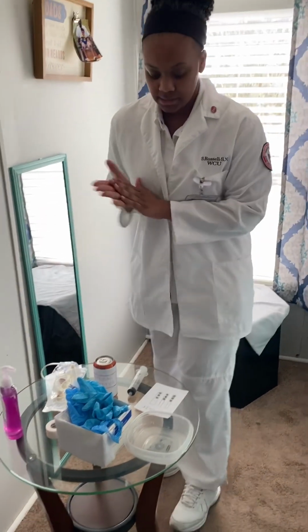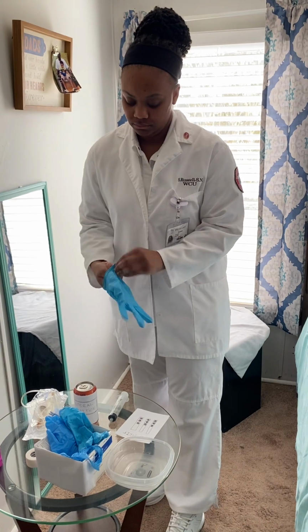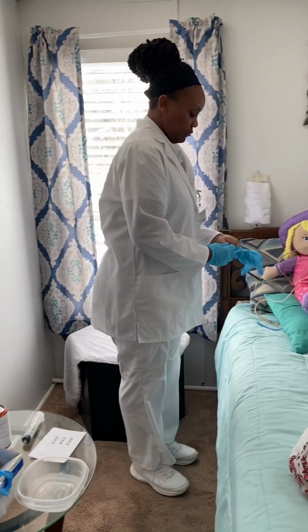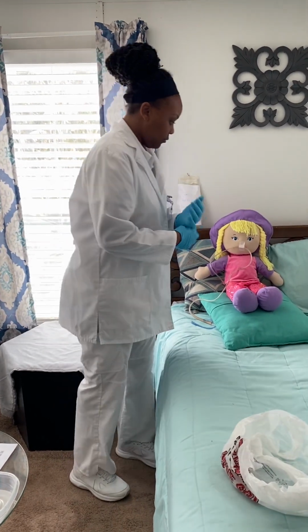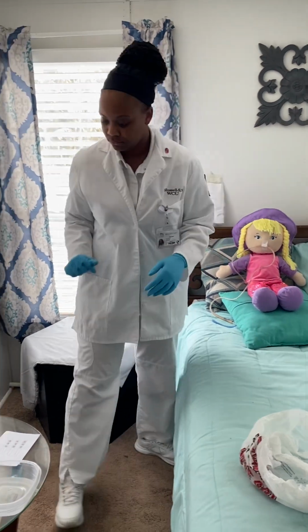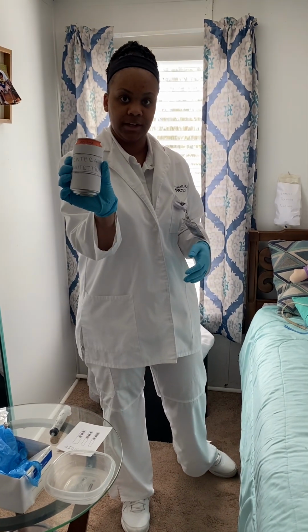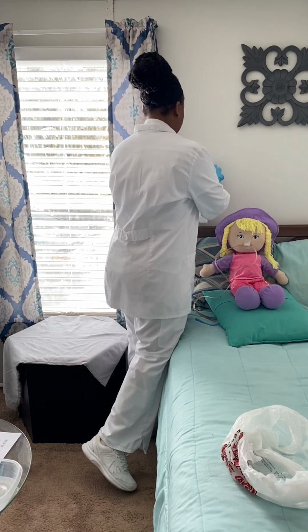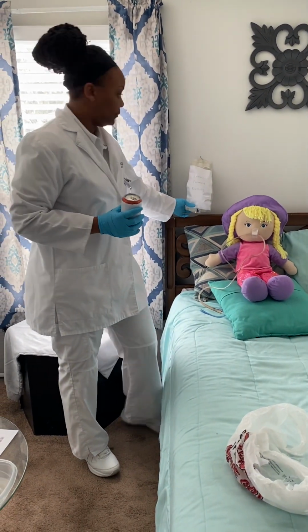Then I would wash my hands. I will don clean gloves. I will position the patient into a high Fowler's position. I'll grab my enteral nutrition feeding can. I will shake up the formula. At this point, I will pour it into my enteral feeding formula bag.